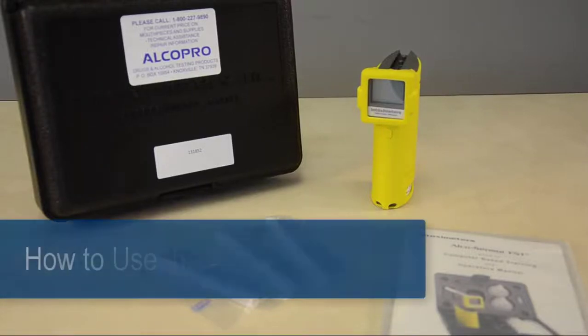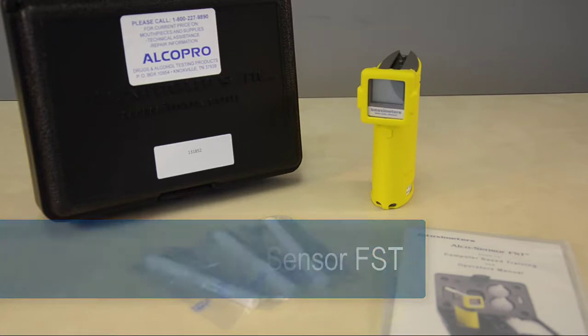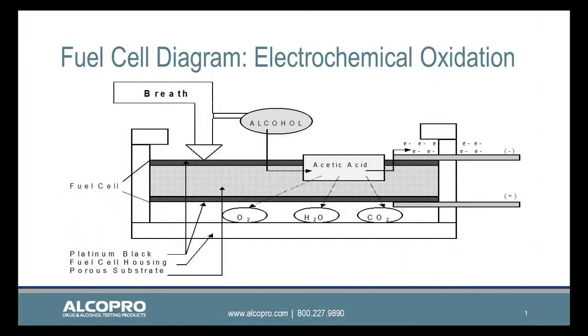The AlkaSensor FST is trusted by law enforcement and substance abuse treatment professionals worldwide to provide accurate and reliable results. The AlkaSensor FST uses fuel cell technology to analyze and convert alcohol molecules to a breath alcohol content result.